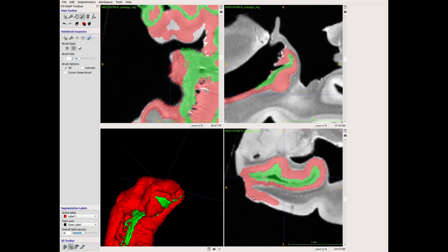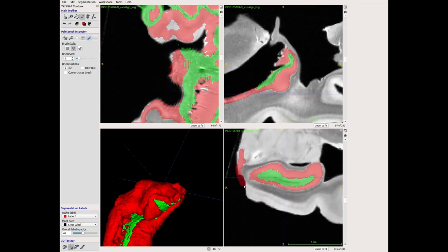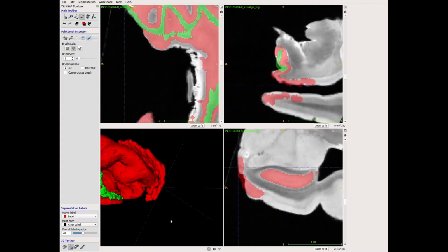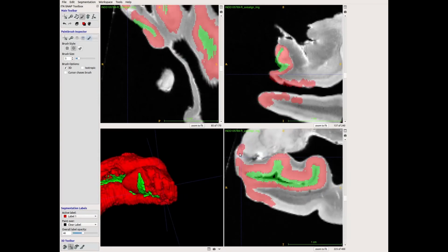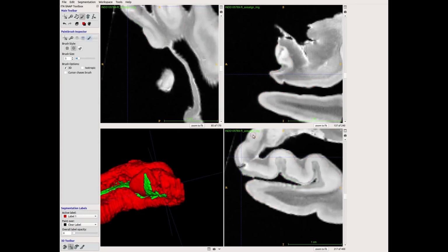Now here we're actually missing a little piece. So this ex vivo tissue sample seems like it got nicked or something. So I'm just painting right over that, even though there's some clear background label. I'm just including that for now because trust me, guys, I know that it's just a little missing piece of tissue.